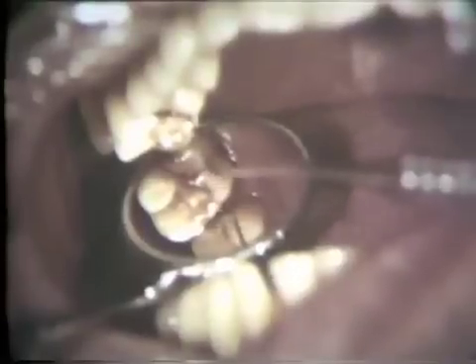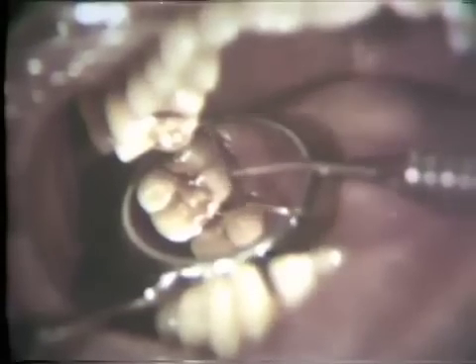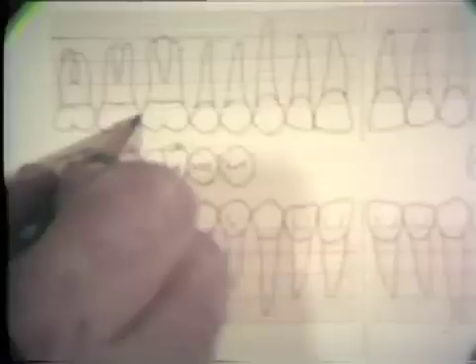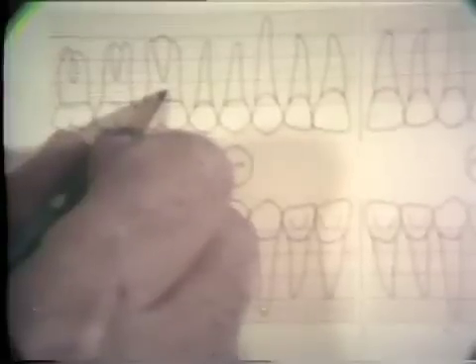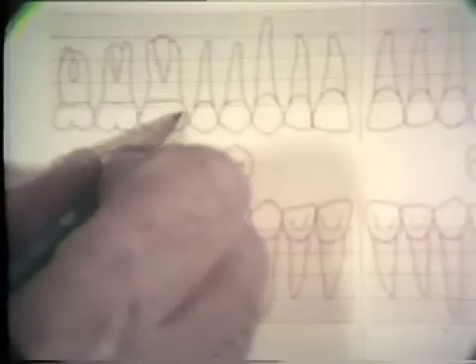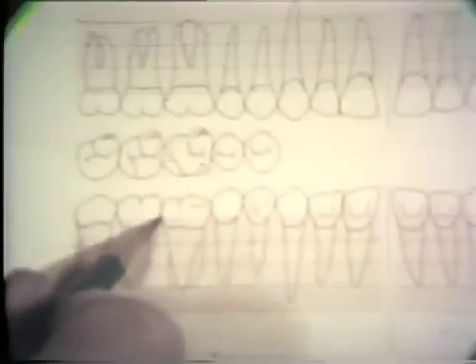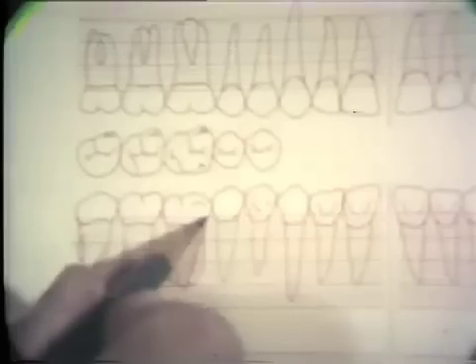Distances from the free gingival margin to the cemento-enamel junction are also measured at the distolingual, the lingual, and the mesiolingual aspects of the tooth. The measurements are transferred to the chart — first for the distobuccal, then the buccal, and mesiobuccal aspects of tooth number three, followed by the distolingual, lingual, and mesiolingual relationships of the free gingival margin to the cemento-enamel junction.